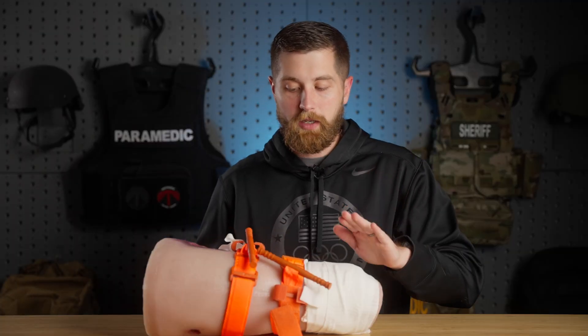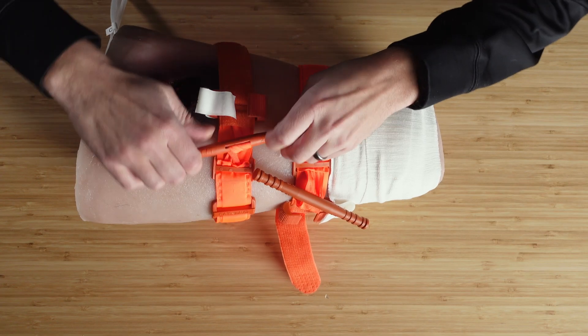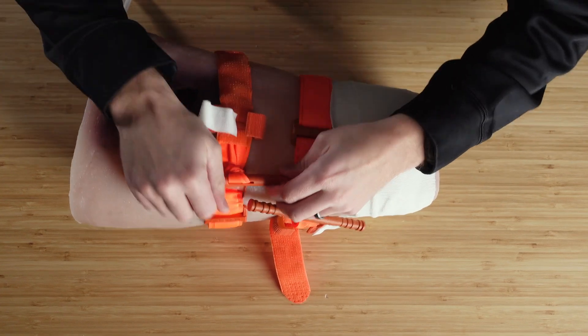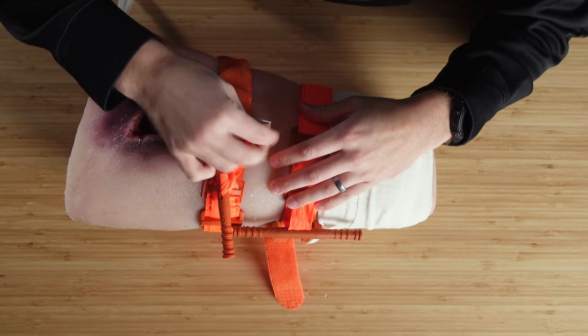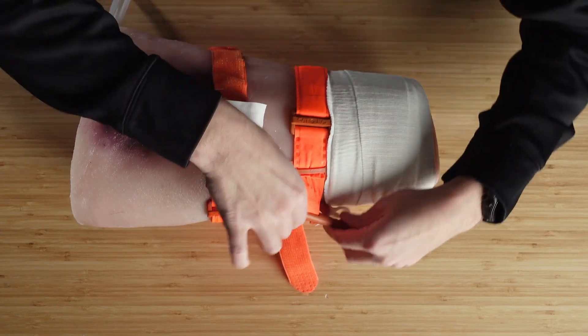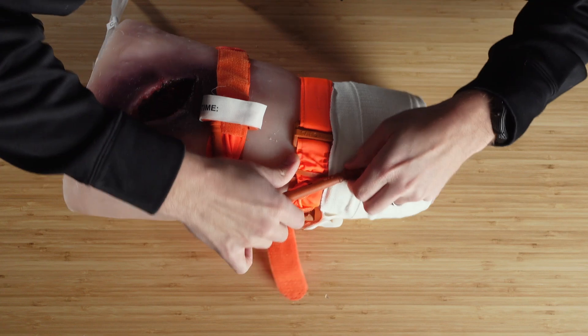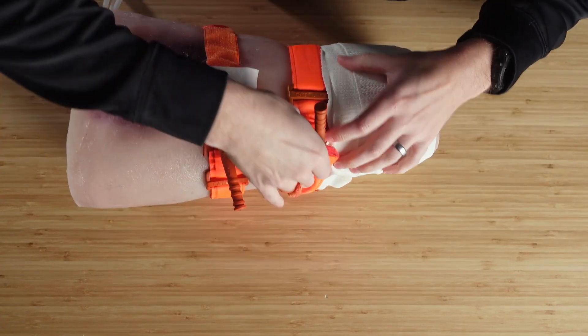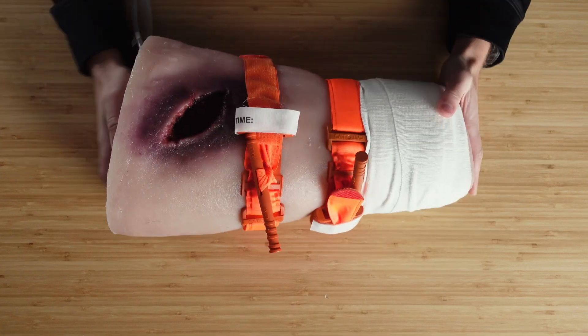Now, if it is starting to bleed and I'm pretty worried about it, I'm going to take the plus-one tourniquet and tighten that down until bleeding stops. If that one doesn't work, I'll go back to the first tourniquet that was applied and tighten that down until bleeding stops — and we're going to stop the blood flow that way.